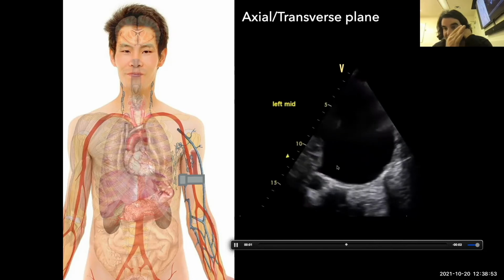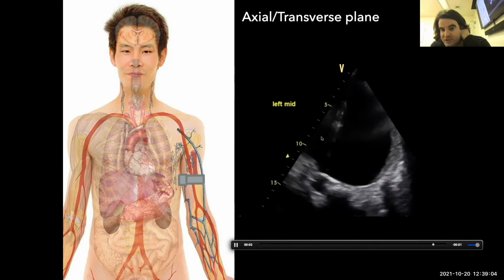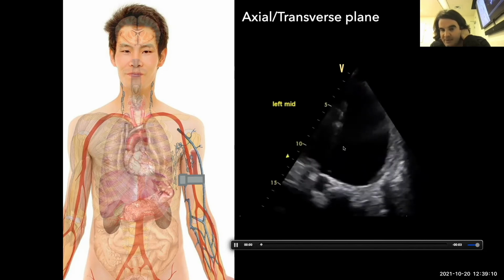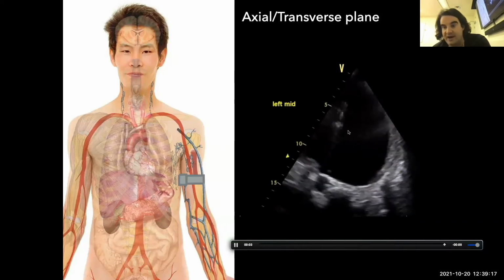And then you can take this probe and sweep all the way up the chest and see how far that effusion goes. And supine, it's the same measurement. 1 centimeter equals 200 mLs. So just measure from the lung to the chest wall. Okay, and I wouldn't take the largest, I'd take somewhere in between. But from here, you can measure from there to there, for example. And so this is quite large, probably corresponding to around 1.5 liters.